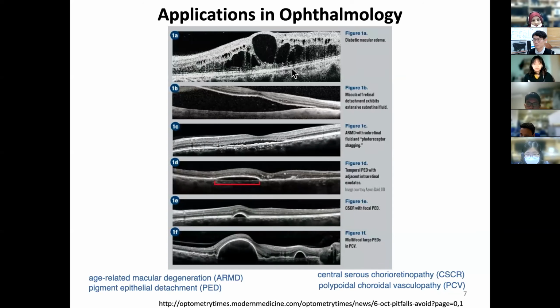Here comes an example of a commercial OCT system. You can see here there is a disease, diabetic macular edema. Edema is a filling of water. You can see this verge of the macula, and also retinal detachment. So there's a gap from the detachment of the retina. And also ARMD here is age-related macular degeneration. My mom actually has this macular degeneration. This can lead to blindness in the end. So this is a very devastating disease without many treatments available. In fact, there's no proper treatment.